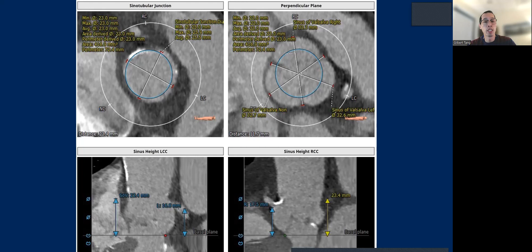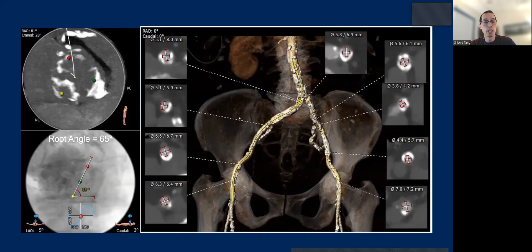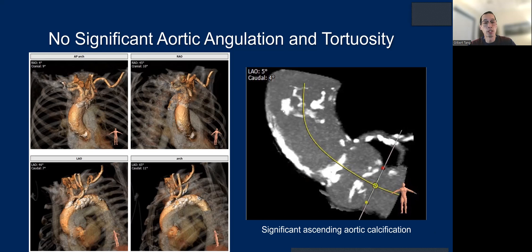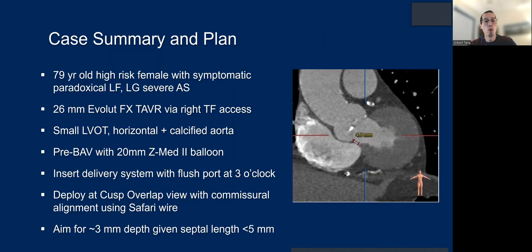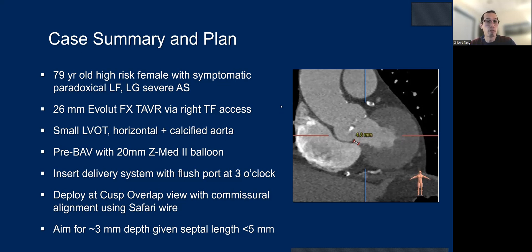There are very generous sinuses. Access can be a little challenging with some calcification in the iliac arteries. There's a horizontal root at 65 degrees and a tricuspid aortic valve, as well as a shell of calcium in the ascending aorta, making this a potentially higher risk of stroke. The septal length is 4.8 millimeters. We're doing a 26 Evolut FX via right femoral approach — small LVOT, horizontal aorta, calcified aorta, certainly not straightforward. To avoid post-dilatation with the small LVOT, we do a pre-balloon dilatation with 20 millimeters.